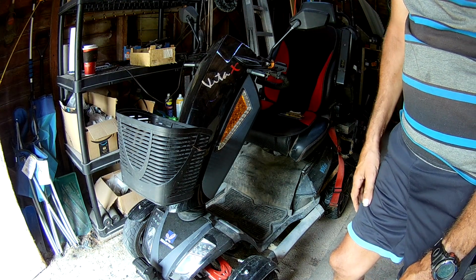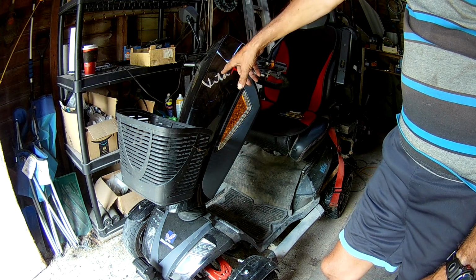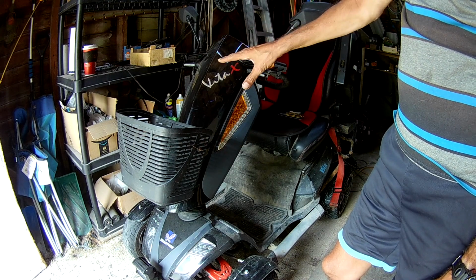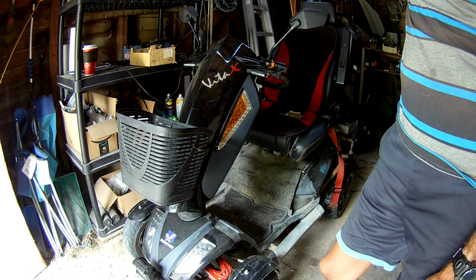So the first thing I'm going to do is take my basket up. I'm going to open this up, and I'm going to secure the relay for my front headlight. Because I'm pretty sure that's what's rattling up top, because it's up top here somewhere. And that's the only thing that really moves in there.